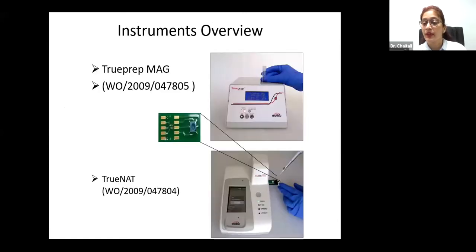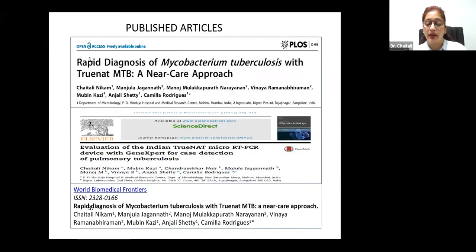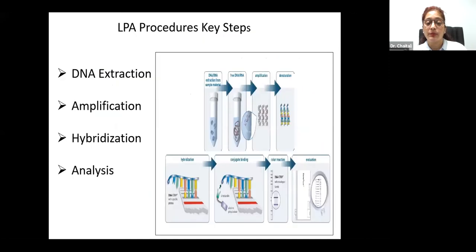This is another instrument which is now deployed by the government into the setup for TB diagnosis, that is TruePrep and TrueNat. Here are a few of the publications.